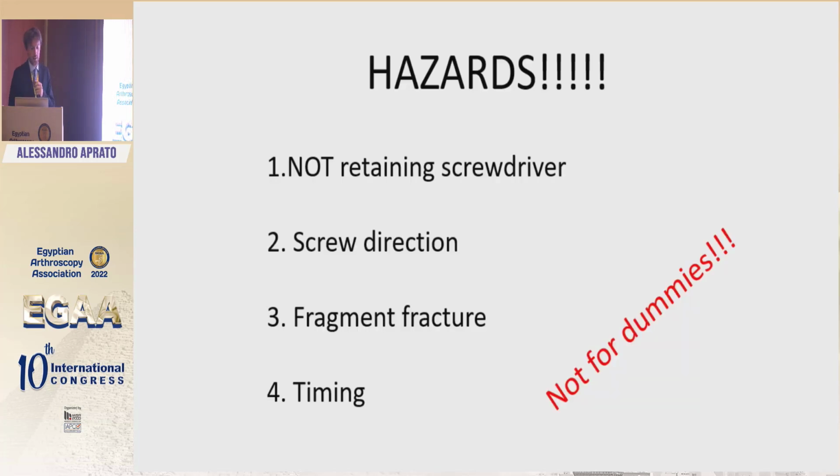But it's very interesting because we have to learn how to put in our screws. The screw direction is not the same as we are doing normally. We avoid penetrating inside the joint because we can see it, but we don't know if we get out from the outer surface of the acetabulum, so it's not easy. And since you are in lateral decubitus, you can't do the obturator and the alar iliac views, so sometimes you're not perfect. You can't understand if you are perfect with your direction.